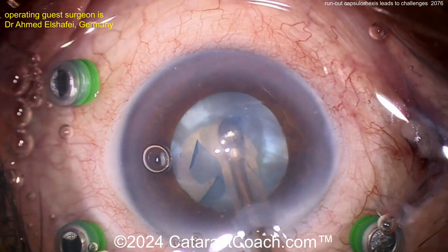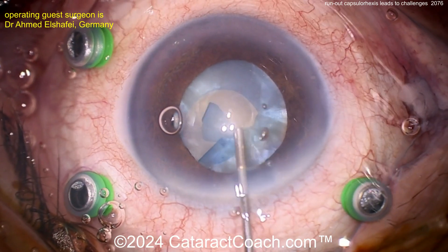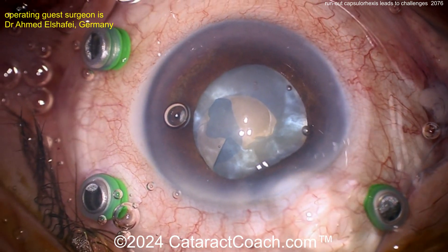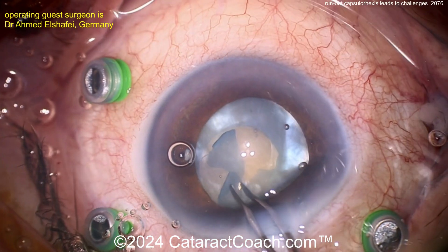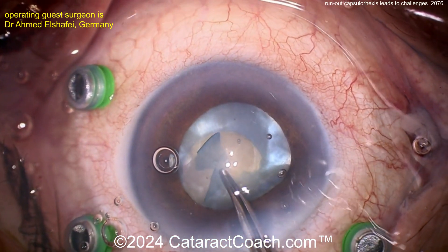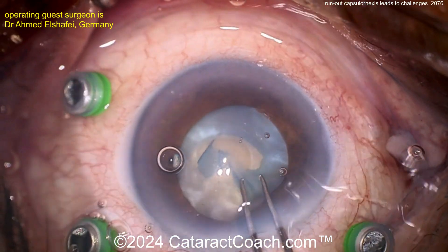Depressurize the capsular bag — I like that idea too. Could have done that at the beginning with just a cannula, just rocking the nucleus. Here's more viscoelastic going inside the eye. Let's see if we can rescue this using that little technique — grabbing it here and, nope, it doesn't really want to go. Looks like the capsulorhexis has already gone out towards the zonular support.